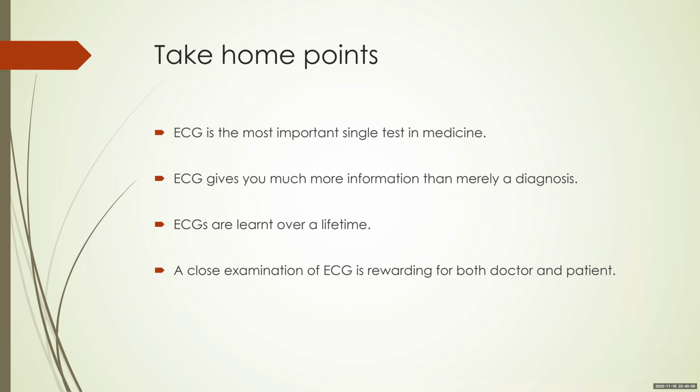A close examination of the ECG is rewarding for both doctor and patient. If you are able to master the ECG, it is most often that you will save a life. So try to read about ECGs, try to learn about ECGs, and you and your patient will both be rewarded.